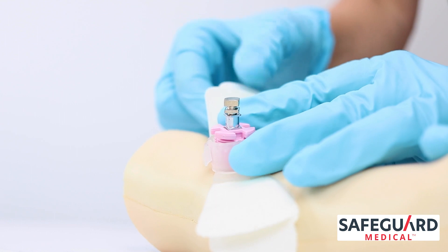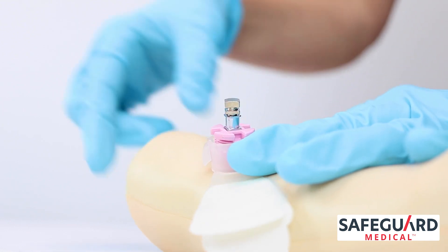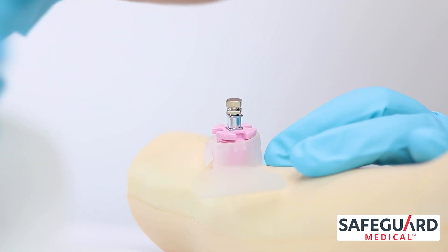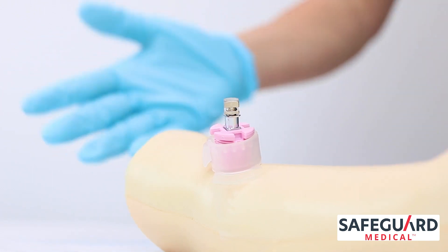Remove the paper liner from the underside of the fixation dressing to expose its adhesive tabs. Use your fingers to affix the adhesive tabs to the patient's skin, ensuring that the fixation dressing is firmly adhered.